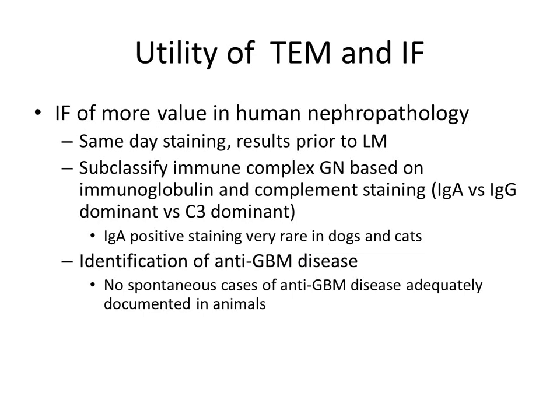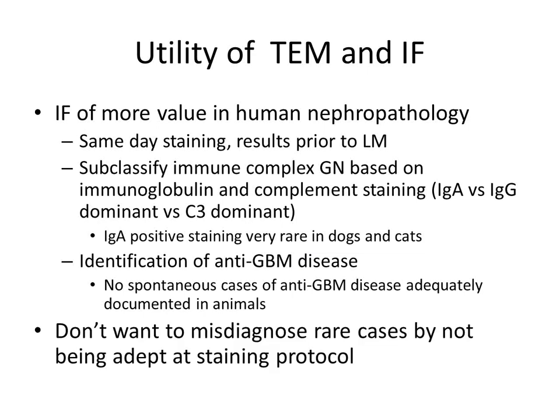But in humans, the IF is going to tell you, is it linear or is it lumpy bumpy? And that's why IF takes a bigger role in human nephropathology. And so, again, the fact that we don't want to misdiagnose these kind of rare birds simply because we're not adept at our staining protocol.